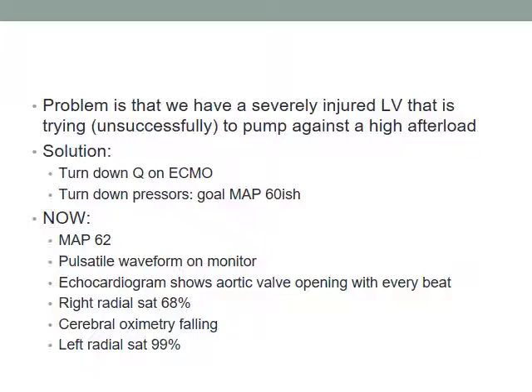This gets into the whole arena of trying to decompress an LV that's not emptying. And if we did all those things and we did not get pulsatility, we could put an Impella in to try to suck out the LV. We could add a balloon pump, probably won't work. We've actually gone to surgery and put a cannula into the LV apex and sucked blood out that way, and put that into the ECMO circuit, with several different things we've done. Our preference in general lately has been Impella, and that's worked reasonably well.